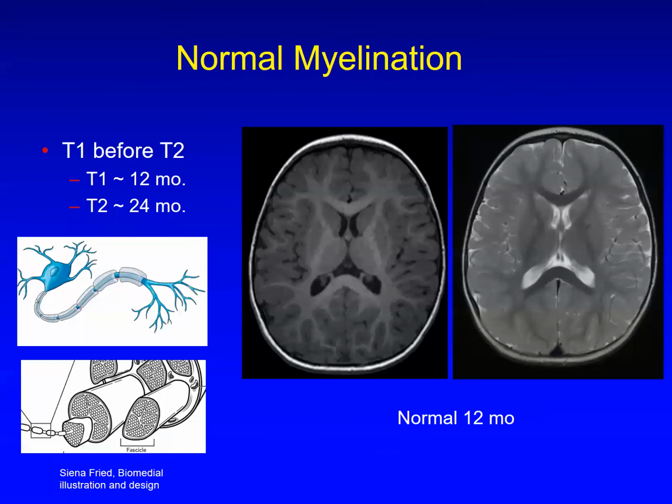But I think also that there are key fundamental concepts and patterns to keep in mind about myelination that are helpful just to give you kind of a framework. And the first is the T1 and T2 changes. So T1 really increases as a patient myelinates, and that's related to fat in the myelin sheath. So fat is a component of myelin, so as you myelinate, your T1 will increase, and then the T2 signal will decrease, and that's associated with decreased water content. So as the axons mature and they become a tighter bundle, there's less water there. So T1 increases and T2 decreases.